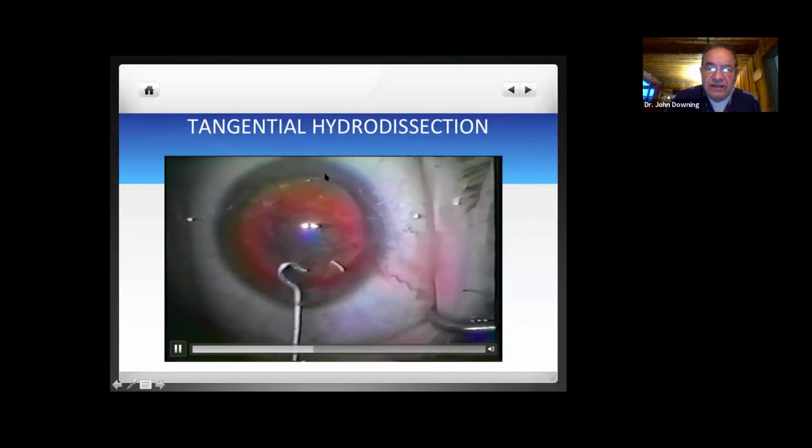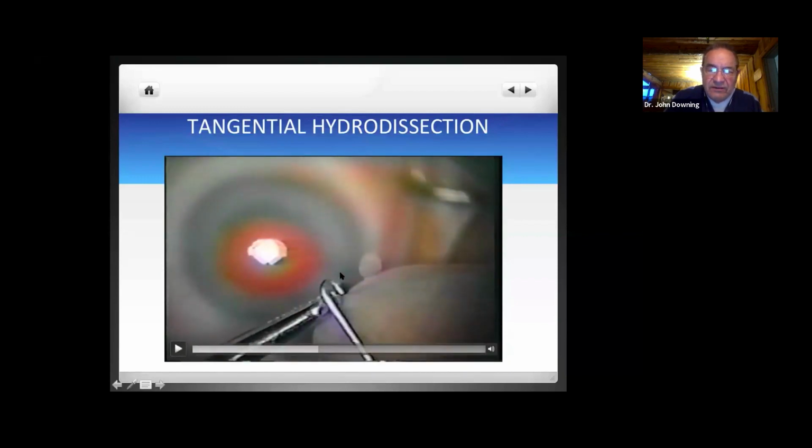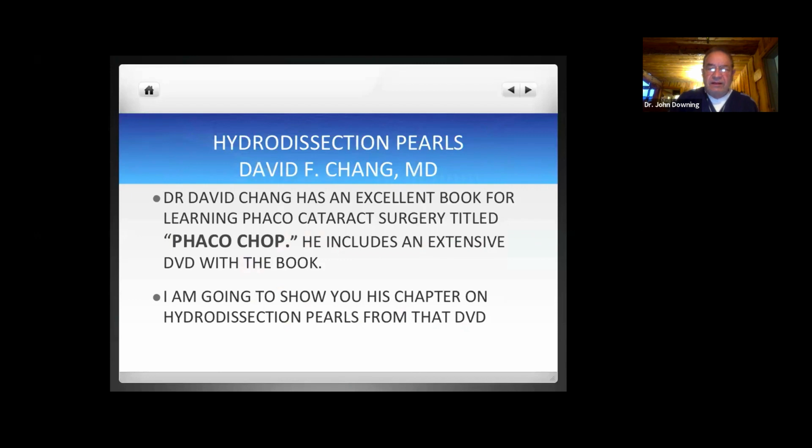Inject as you go around, just under the... I'm sorry. And he's showing that he used a J-shaped cannula. This is from several years ago. And you can bend it slightly to make sort of a 45-degree angle.